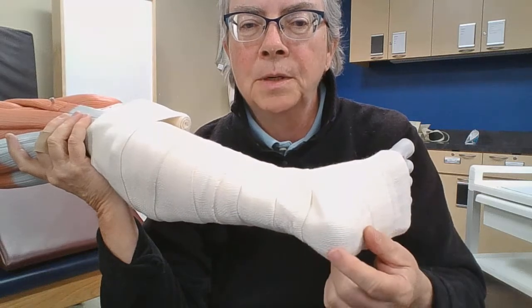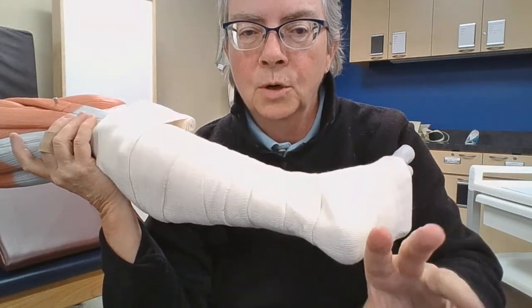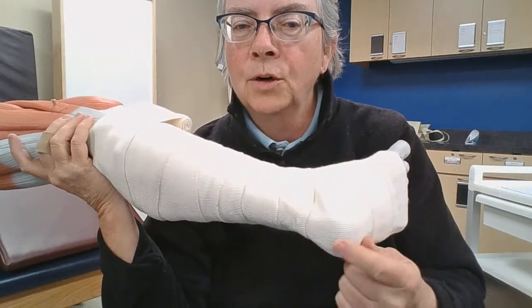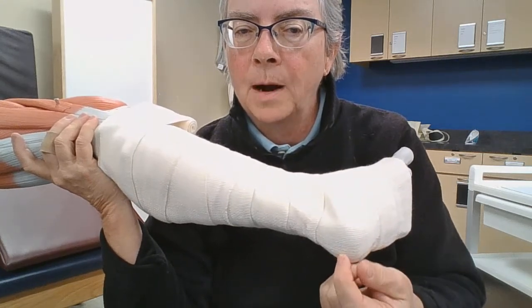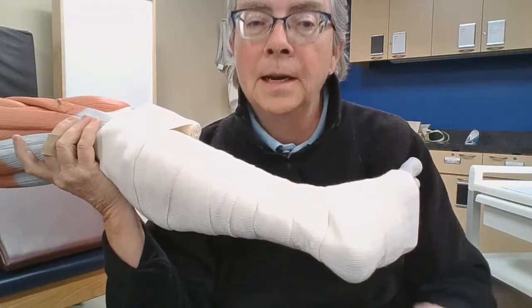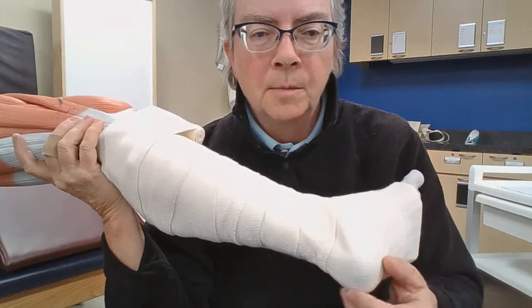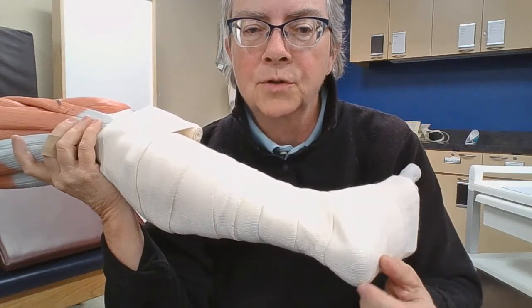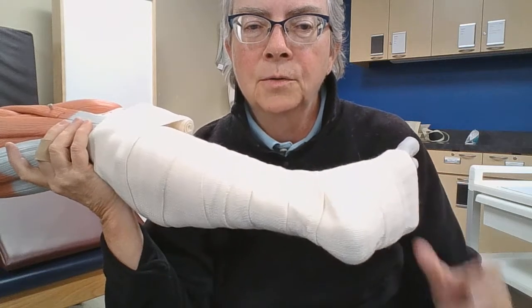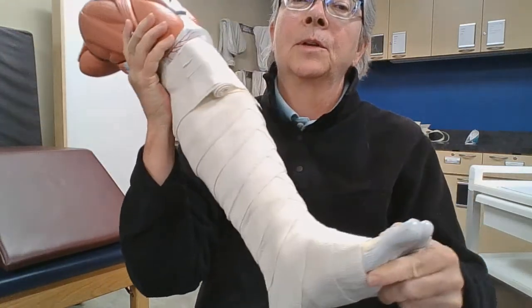Because if there's a gap, what is going to happen there? Well, fluid is going to go where there's no compression, right? It's going to pool and it's going to create a blister. It's just going to pop right out. The blister is going to pop and now you have an open wound, which is a greater problem for your patient, your athlete that's trying to get back to their sport. So no wrinkles, no gaps, really important.